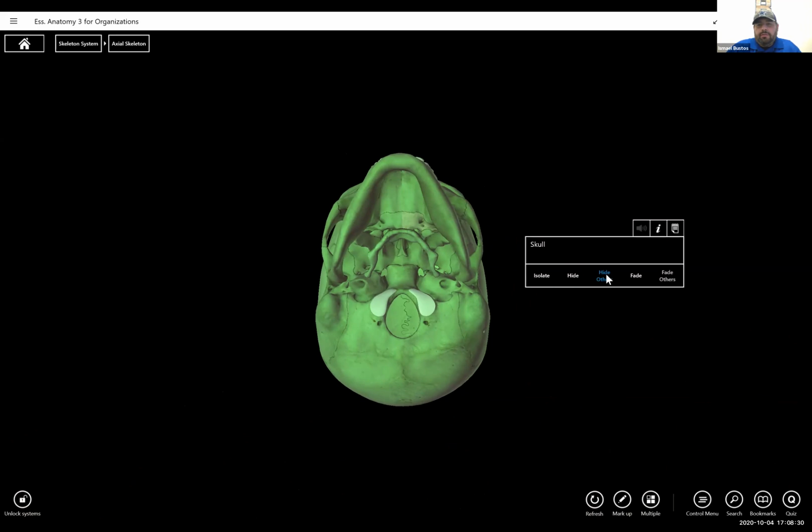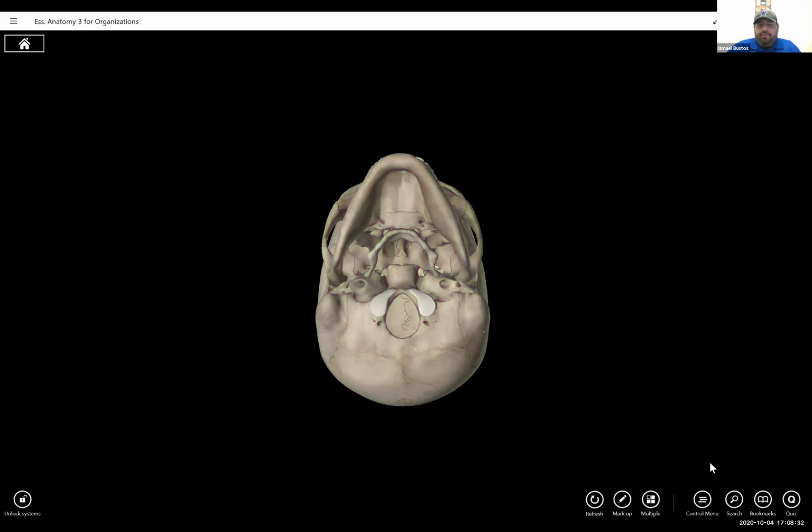Right, so now if I'm here like this, what I'm going to do is center 1.5 inches below the mandibular symphysis, so about right there, or midway between the zygomatic arches. That's where you want to center, right at that spot. These are the structures you want to see, the zygomatic arches. The SMV projection allows you to see those zygomatic arches. Again, SMV, that's what we want to see.